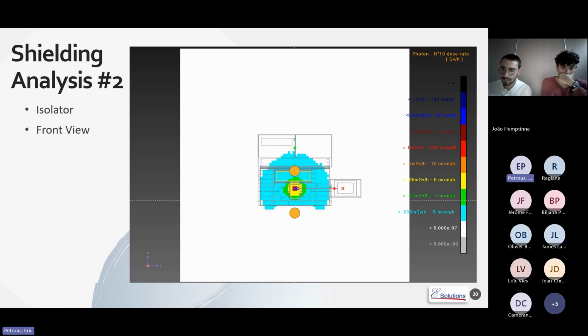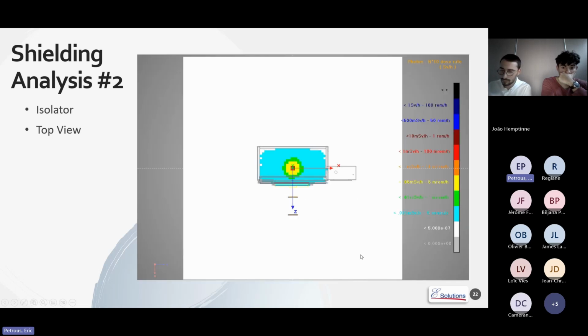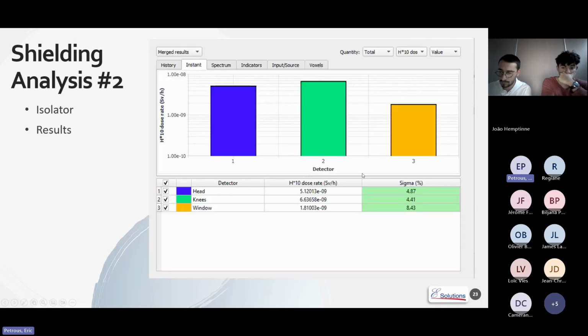A second example is we also do this with our isolators, which are very similar to the LAF hoods. The isolators typically just have thinner shielding than an SCC. They're smaller. And again, we have these in different styles, different lead thicknesses. But you can see where the source is again with our custom zoning. And you can see that all the results are looking good. It's white outside, which according to this is very, very low dosages. Again, we've got some results from the detectors that we place throughout at head, knees, and at a window. But those are more of the complex simulations that we run. We would typically run those for about 24 hours.